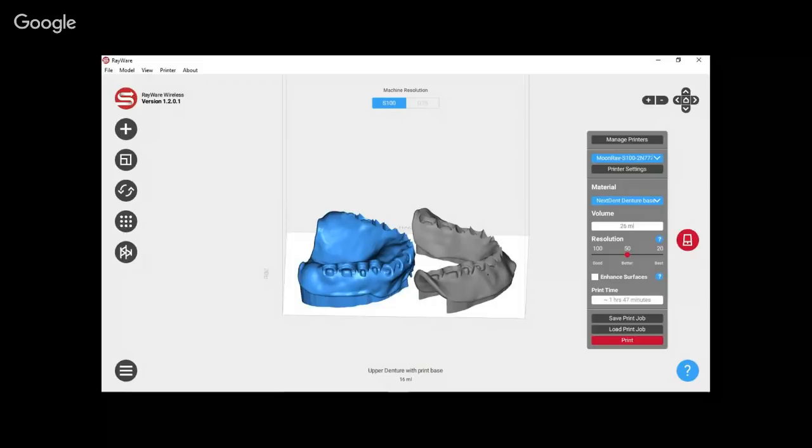And so this is something you'll have to jump out into Mesh Mixer. This is not something we want to bloat the program by including in Blue Sky Plan, but you could go around and drag off some vertical components that go down from the border everywhere. That does two things. One, it allows you to lay the model down flat, and two, it allows you to print without supports. And so you're going to have much less final cleaning to do.